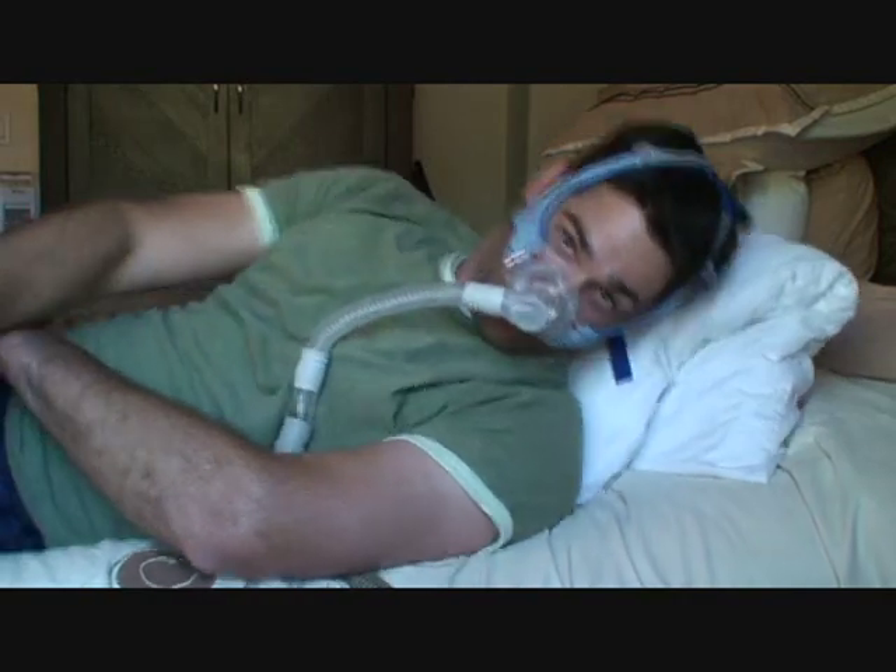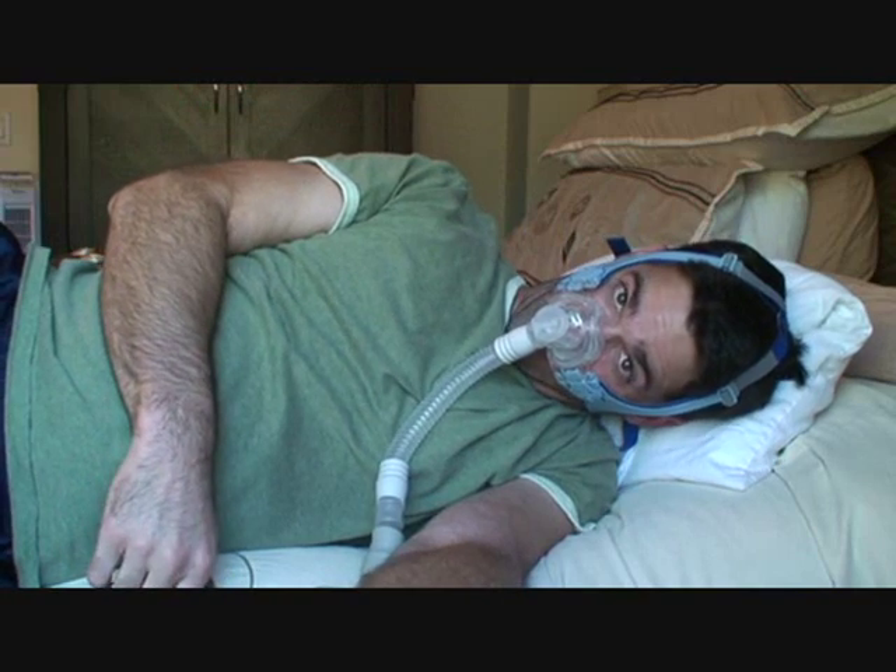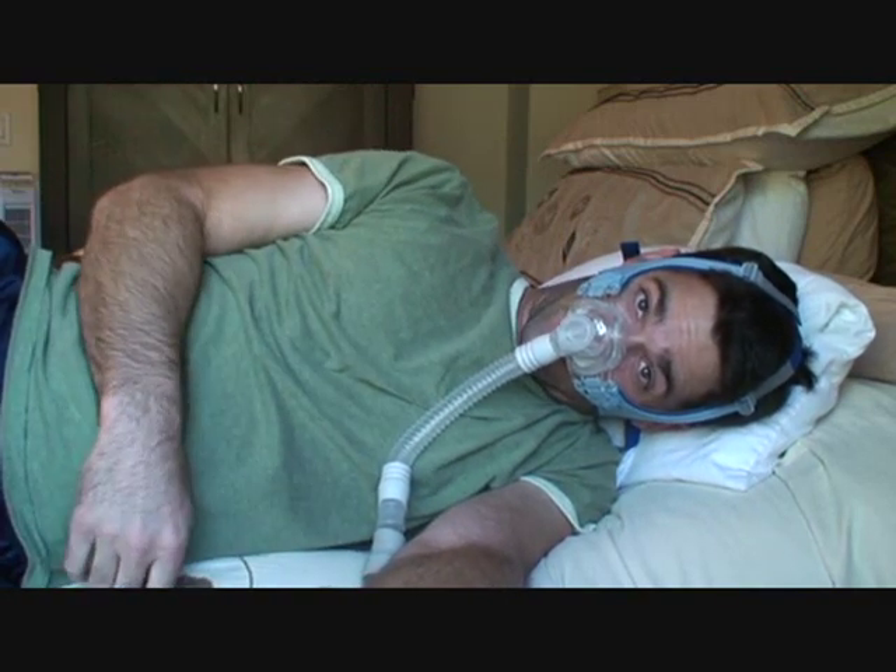That's it. If you need to sleep on your side, just try to sleep with your head kind of tucked to your chin. You can still breathe no problem — the air just can't get into your stomach.